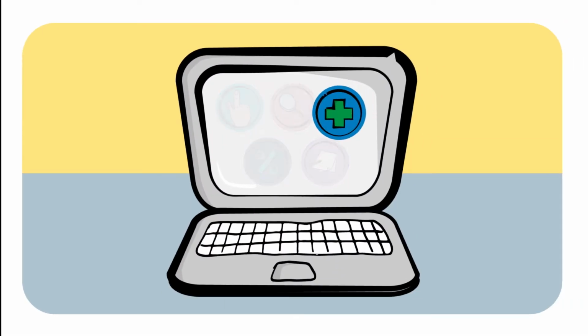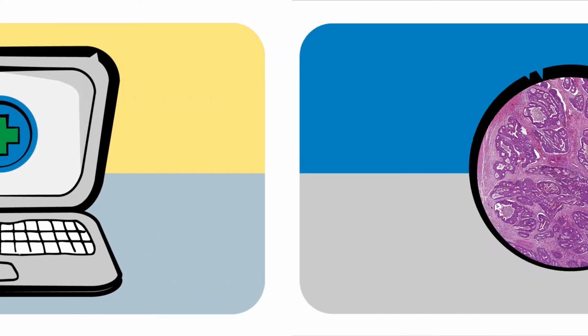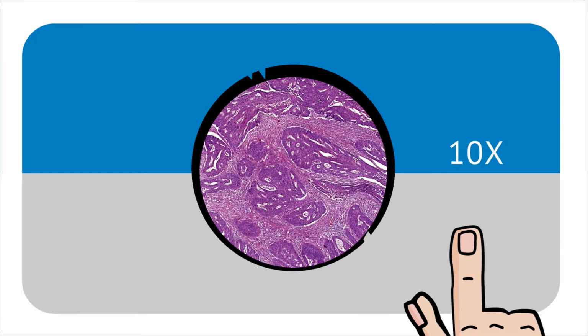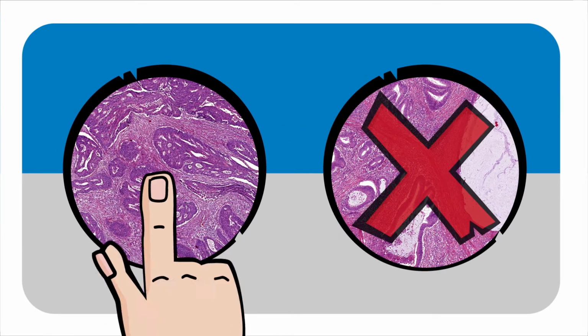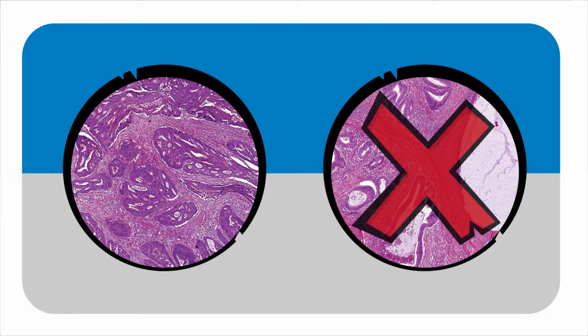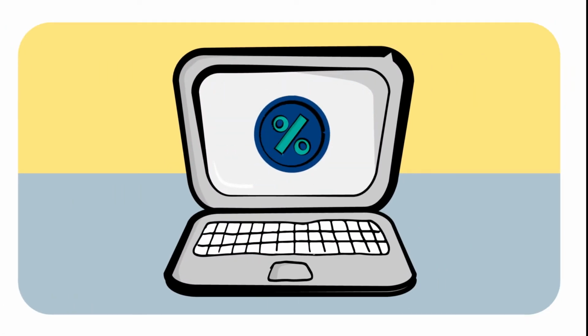3. Zoom in. Subsequently, zoom in and view that with a 10 times magnification. Ensure that tumour cells are visible on all 4 sides of the area, preferably with as much stroma as possible in between.